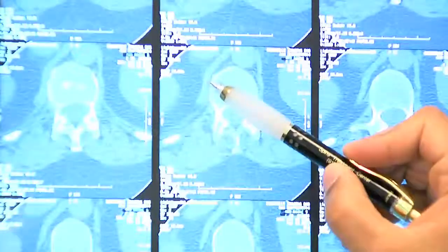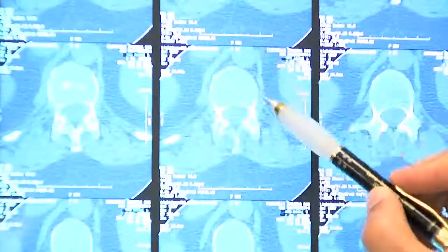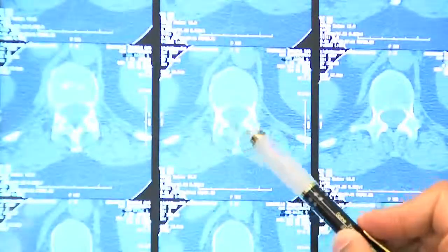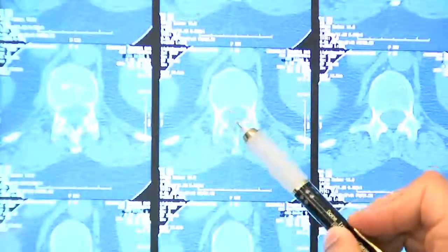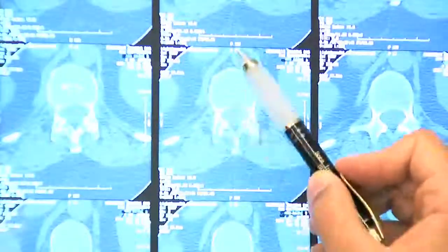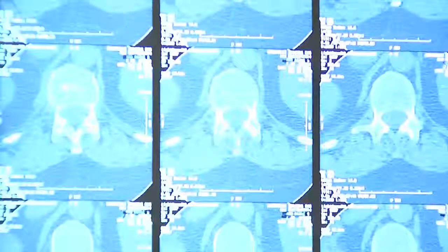You can see this is the aorta and the vessels coming out. These are the muscles — what we call paraspinal muscles — and this is the middle of the spinal canal. You can't see the nerves very well, but you can see the bone very well, so if you have a fracture or tumor you can see it quite well.